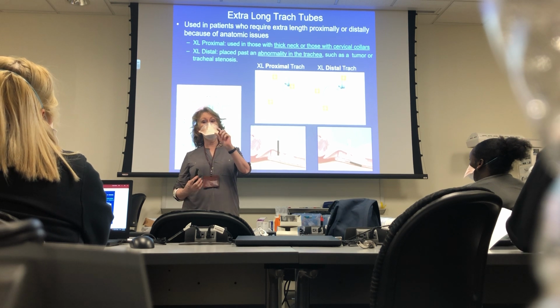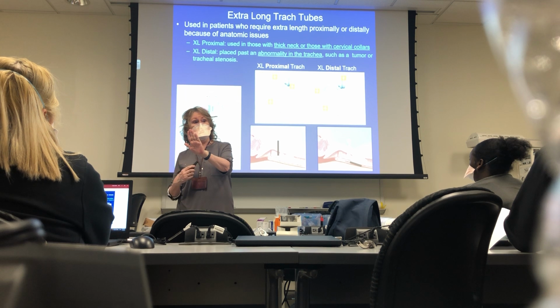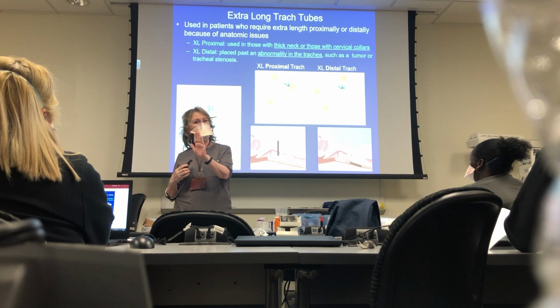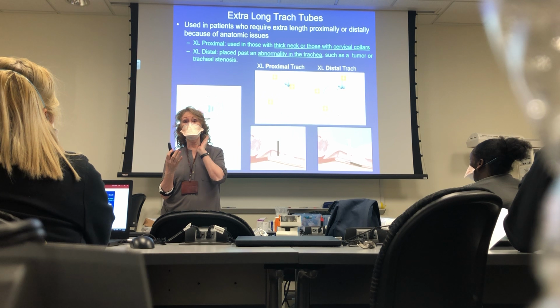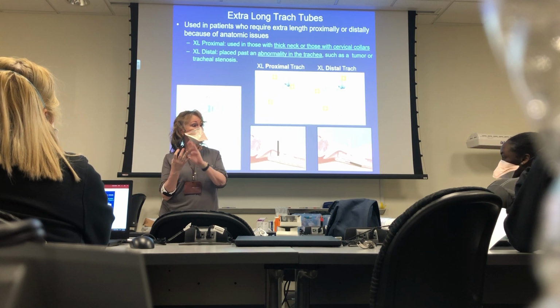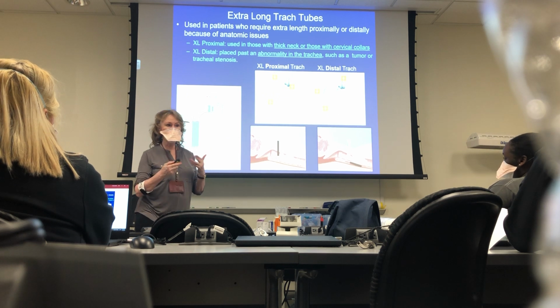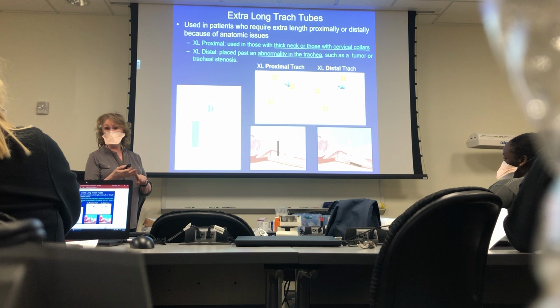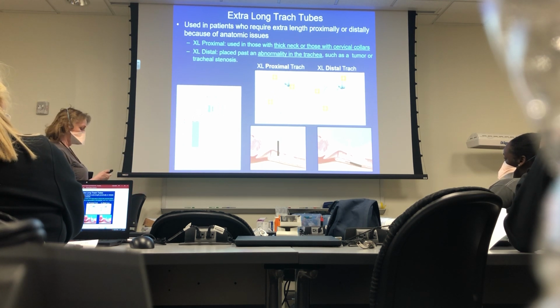Or if you push the trach in just a little bit, it seals. Very tall, thin person, or somebody that may have some abnormality here, you say, maybe we need to try an extra long distal. The residents and physicians will not know there's a problem unless you tell them. And it's usually with you noticing high pressures, no seal, you can't keep a good seal and things are leaking.